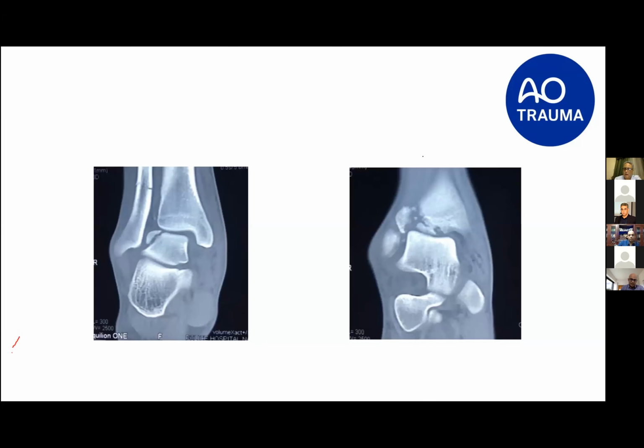This is the first thing. And we know that the amount of intra-articular debris, osteochondral fragments that you leave inside is directly related to the arthritic process that might happen not in 5 or 10 years, but in 2 to 3 years' time. The other thing that you can use the arthroscopy for is to evaluate the syndesmotic part of your fixation.